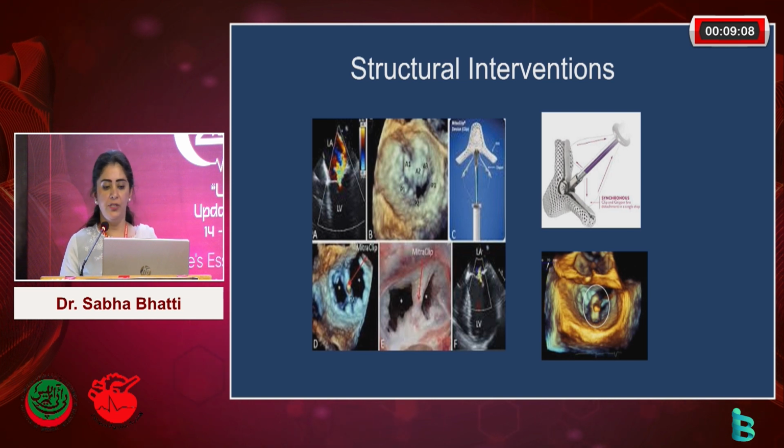So those include TAVR, ASD closures, VSD closures, perivalvular leak closures, and what you see up here in the imaging panels are the mitral therapies like MitraClip or similar to a MitraClip, the PASCAL device, which basically clips the mitral valve and forms what is similar to an Alfieri stitch that is placed during surgery, giving us this figure-8, owl's eye pattern, where you just take a widely open mitral regurgitation orifice and convert it into 2 smaller orifices.